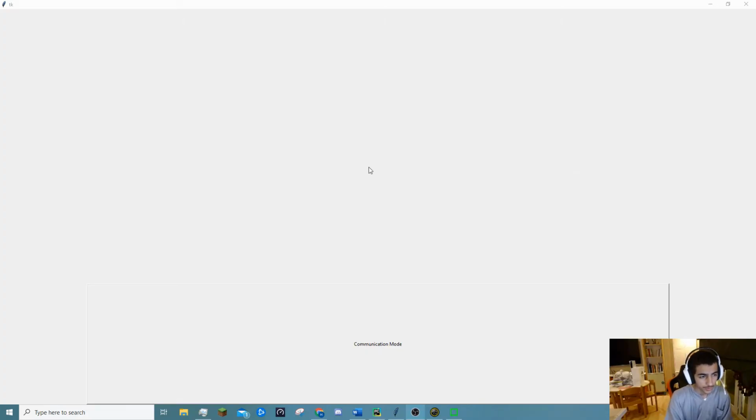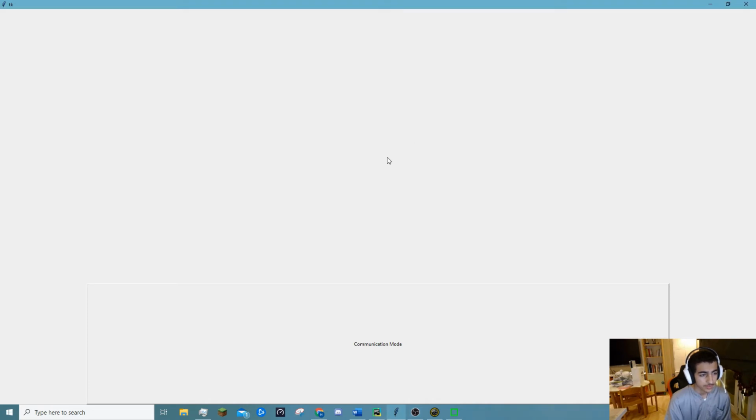The second part of our wheelchair is the communication mode. So how does it work? It's really simple. The communication mode allows the patient to communicate with their caretaker either by SMS or by voice. So let's take a walkthrough through it. This is the simple GUI we've decided to take. As you can see, the buttons are large so that the patient can easily maneuver.